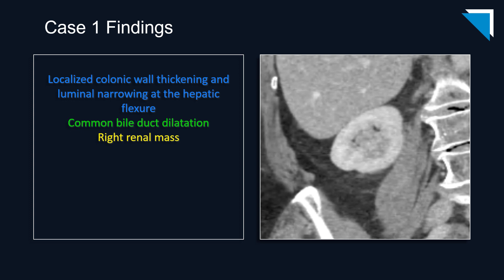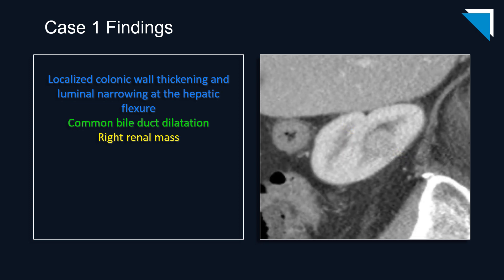The finding is frankly even more subtle on the coronal images, and perhaps a bit less so on the sagittal reformatted images. This case really underscores the importance of sticking to your search pattern and not becoming distracted once you've made important findings — and also to utilize the coronal and sagittal reformatted images in every case, and request them if you don't have them.